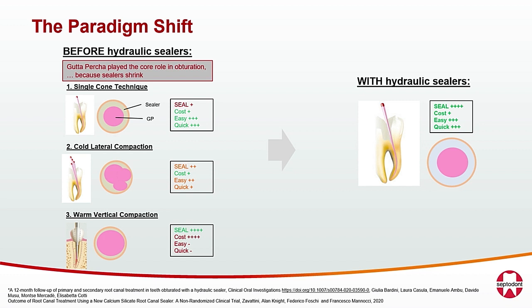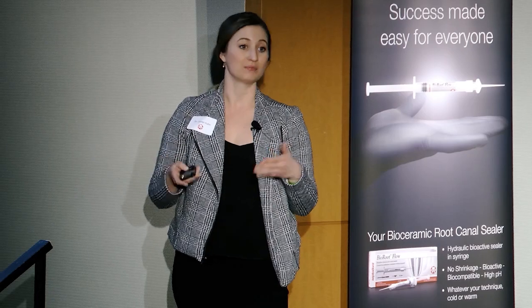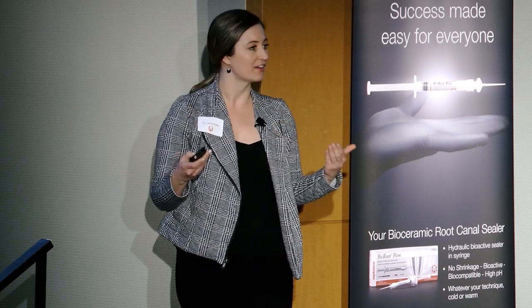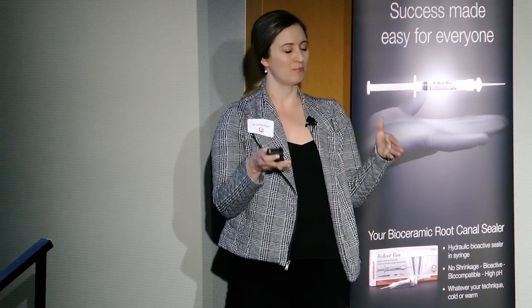So it almost seems too good to be true, if you will. And as an endodontist, I'm happy it is true because obturation can sometimes be unpredictable. But I do think that with hydraulic sealers and bioceramics, as they're also called, this is possible. So it's essentially a modified single cone technique, but we're maximizing sealer, minimizing the use of gutta percha, if you will.